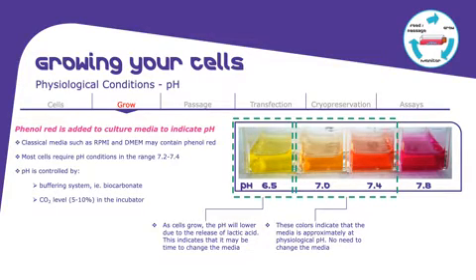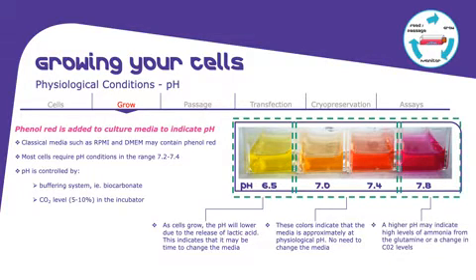It is still safe to keep cells in that media as well. However, probably tomorrow you would need to change the media already. And if we look at the last one at 7.8, you can see that the higher pH may indicate a very high level of ammonia from glutamine, or some changes in CO2 levels in your incubator. So maybe this is a time for you to check if everything is okay with your incubator.